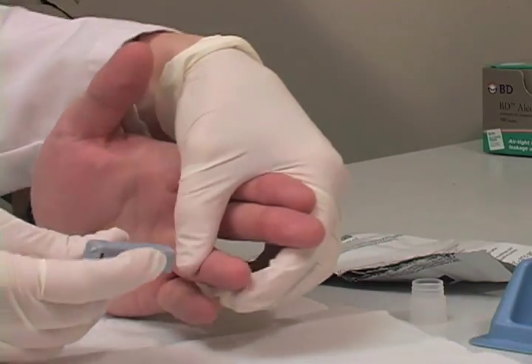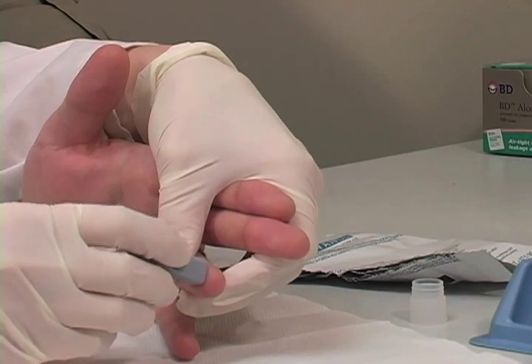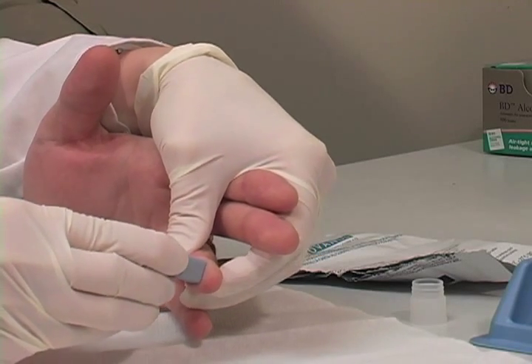Puncture the skin with the lancet. Discard the lancet in a sharps container. Wipe away the first sign of blood.